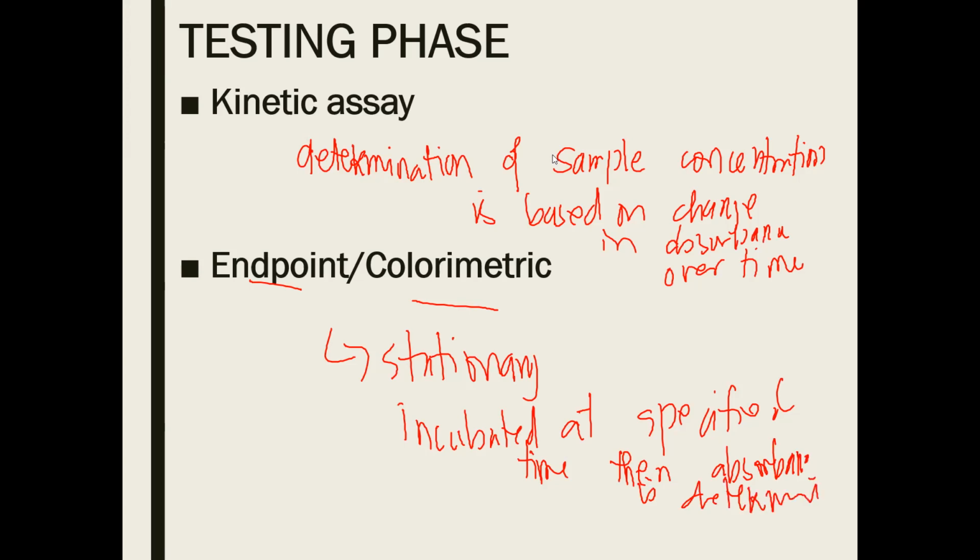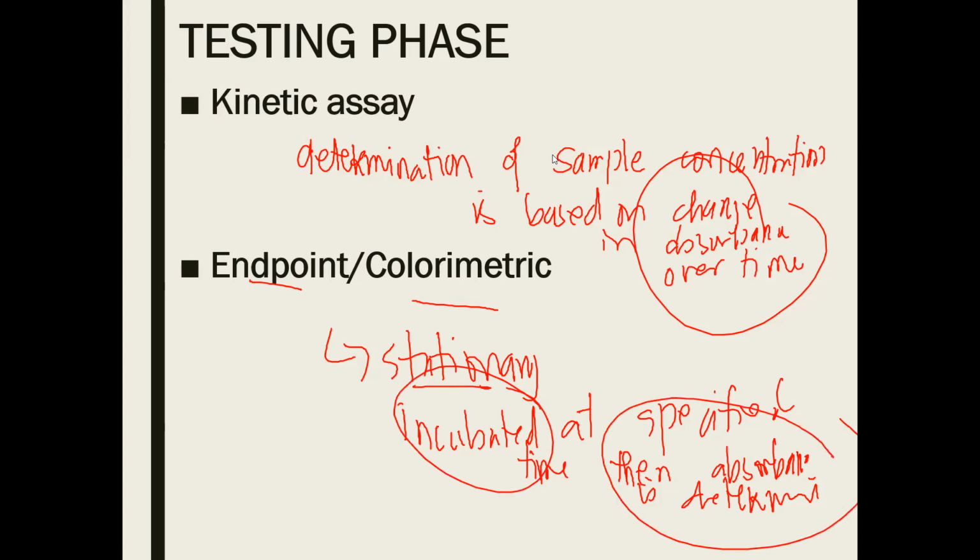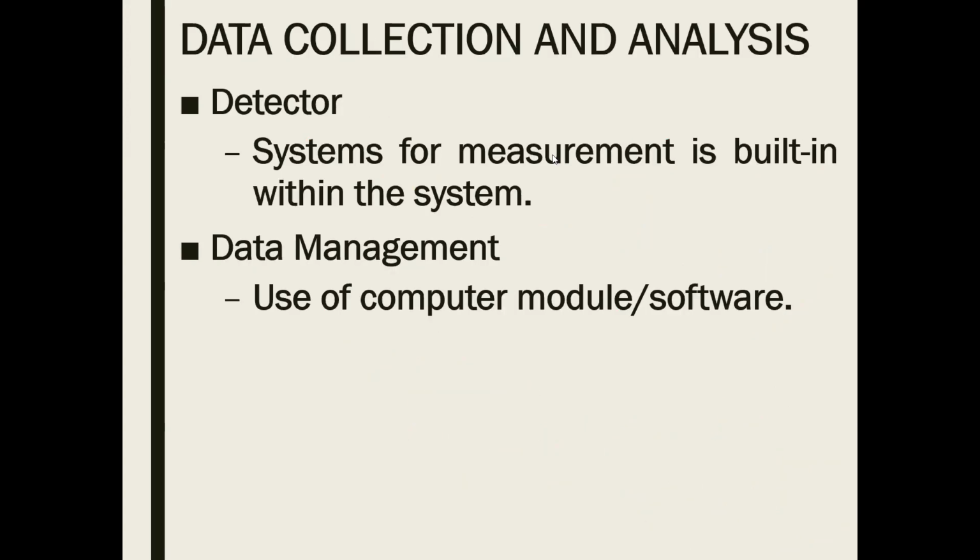In kinetic, meron pang change in the absorbance over time. In endpoint and colorimetric, stationary, and there is an incubation to a specific time, and then the absorbance is determined. Now, kapag po sinabi nating detector, no, detector is the system for the measurement, built in within the system. Data management, ito yung computer, ito yung software na ginagamit po natin.